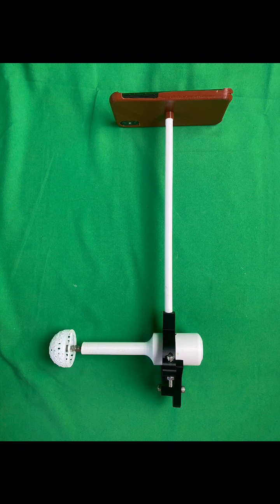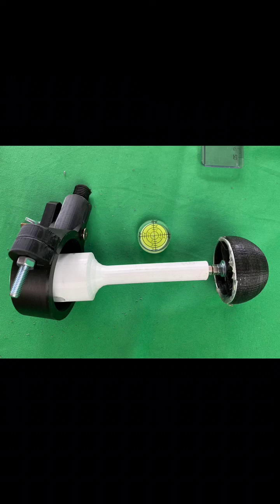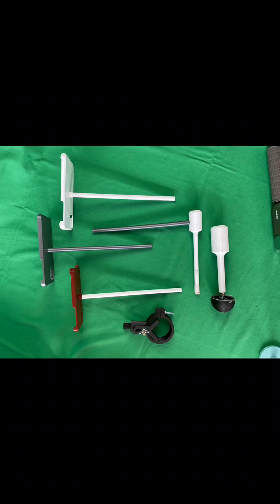A clamp tool, CT. This tool is a simple clamp attached to the handle of the inserter or reamer that has a slot designed to receive, perpendicular, the pointer tip side of the case iPhone probe tool, CIPT. The clamp tool must be positioned at 16.5 centimeters away from the tip of the inserter or reamer.